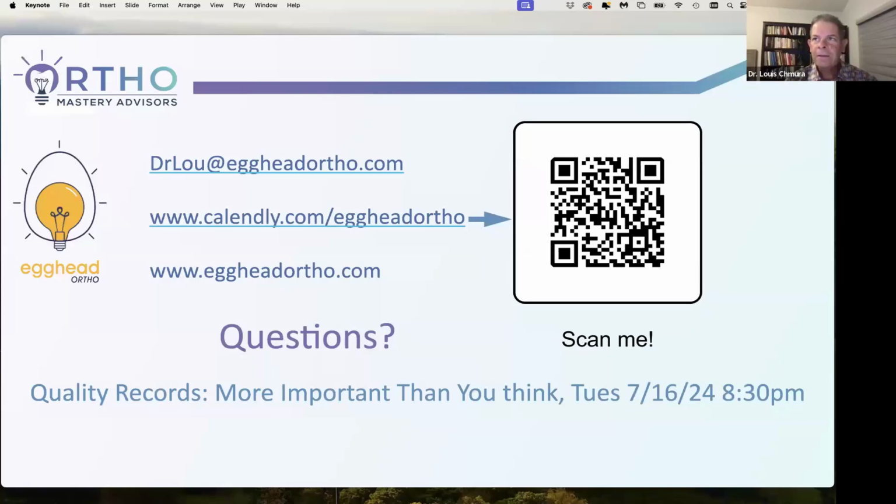Is intruding anteriors relatively predictable with aligners? When done properly, yes. Okay, to just put the aligner on without anything else, probably not. But it depends which ones, if you want the uppers or the lowers, and where you put the forces. But absolutely, it can be done and can be done fairly reliably.